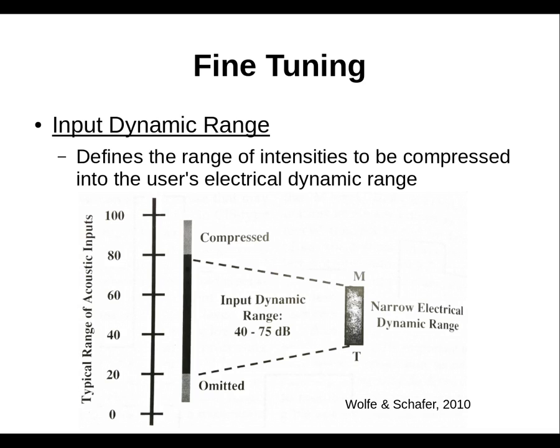It's just completely ignored. For those things that are below 20 decibels, that's probably good. That's probably not going to be a lot of speech information. It's probably going to be a lot of environmental or ambient noise.